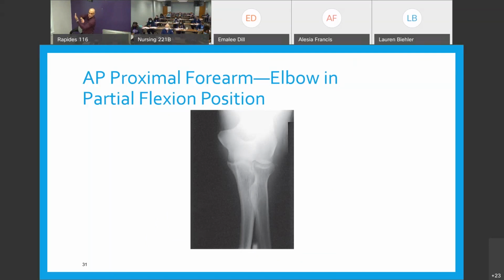This will not be. So you should be able to look at the image and say, okay, what's in detail? I know it's partial flexion and extension, but what is it used to demonstrate? This is demonstrating the proximal forearm because it's in detail, right? Does everybody kind of understand that? That's all on page 200 and 201. We will practice this in lab, and yes, this will be on your lab draws. It's an elbow. It's just keeping in mind that the patient can't or is limited in their movement, and we can work with it. If they're in a cast, we have to do them like that.